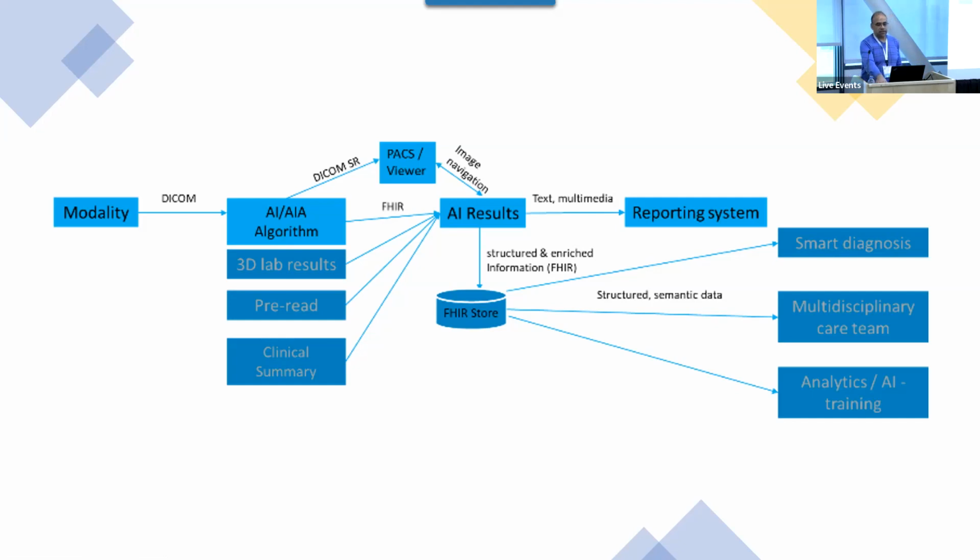And DICOM is, as you all know, well established, and therefore most of the measurements are represented in DICOM, and then we use whether it's an AI algorithm or advanced image analysis algorithm, such as maybe annotation done by radiologists or any image processing algorithm.